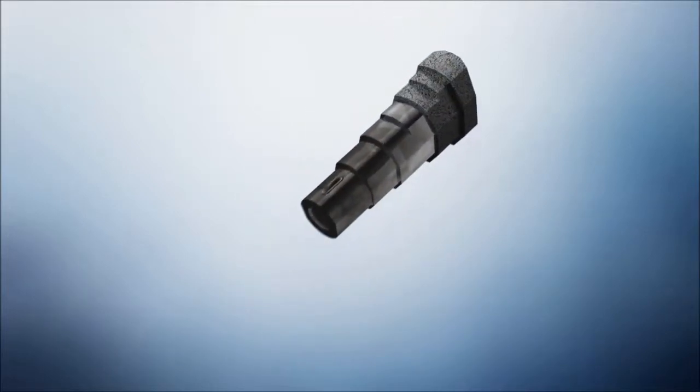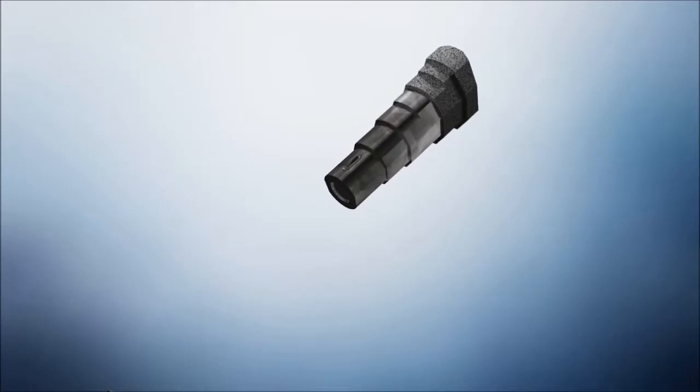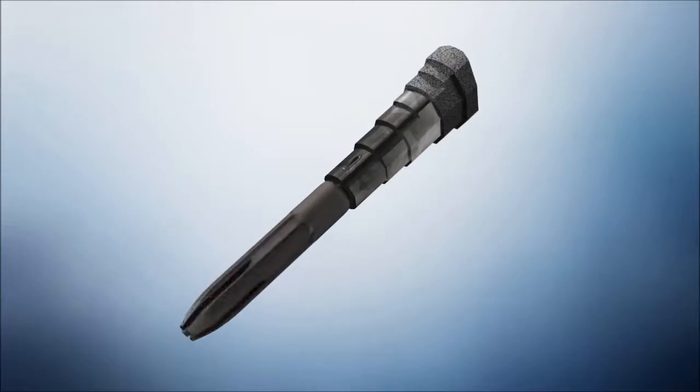Assemble the appropriate stem extension to the femoral sleeve implant using the 2 wrenches to tighten and ensure full engagement.